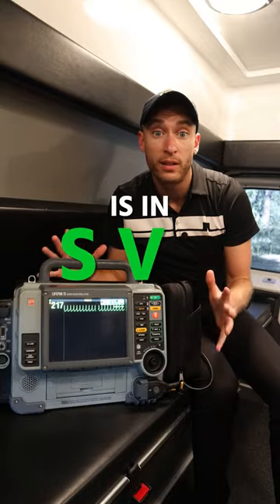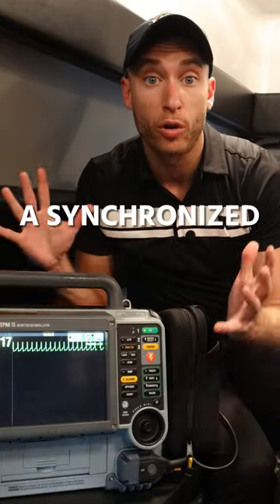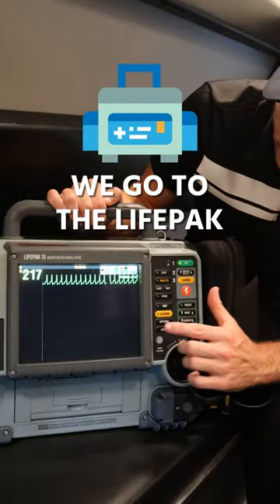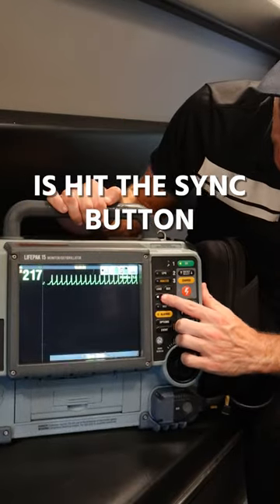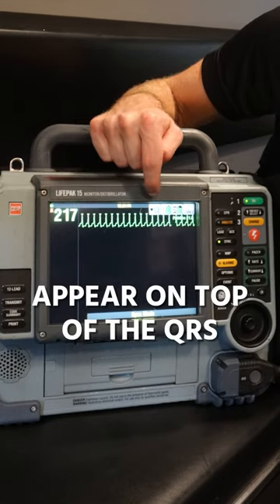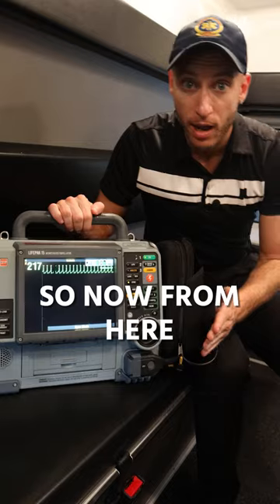Your patient right now is an SVT and we have to deliver a synchronized cardioversion — they're unstable. Here's what we do: we go with the LifePak and we hit the sync button. Look very closely — you're going to see these little triangles appear on top of the QRS.